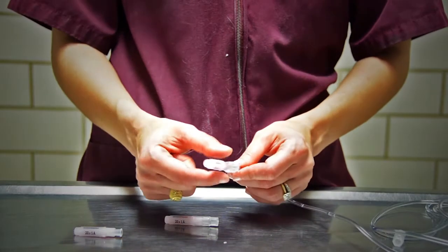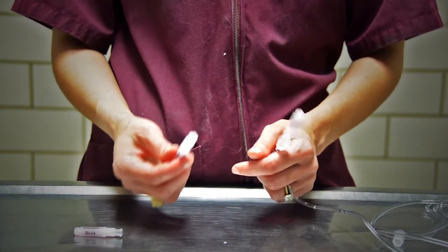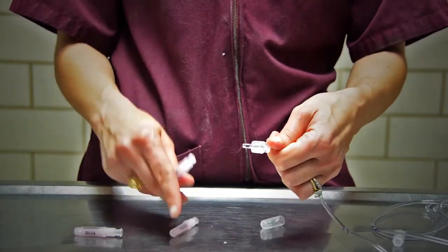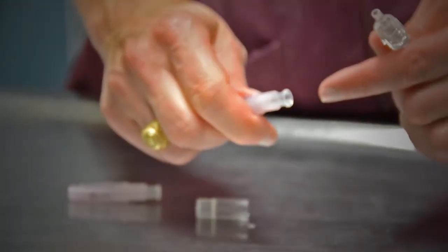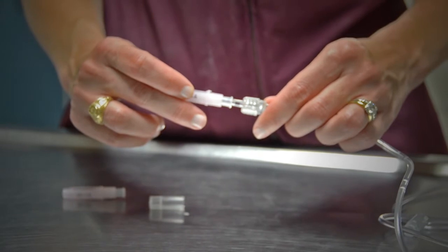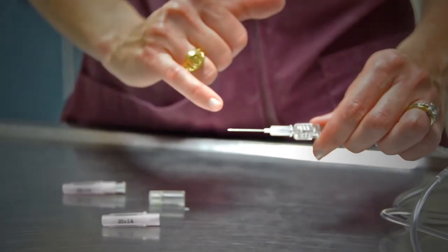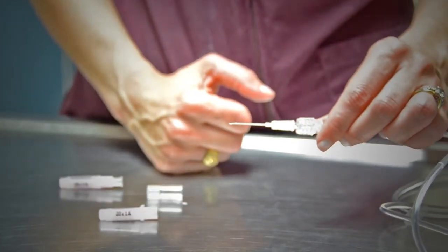After each application of fluids, you're going to leave your dirty needle on your primary IV set. Prior to administering a new bout of fluids, you're going to remove the sterile cap on the end of this needle by twisting. You will twist off the old needle from the primary IV set. You do not want to touch this end of the primary IV set or the part of the needle that is sterile. You will then apply pressure on the needle in the primary IV set and apply the needle. At that point, you can remove the cap on the needle, and you want the bevel, which is the opened end of the needle, up. And again, you do not want to touch the needle because it is sterile.